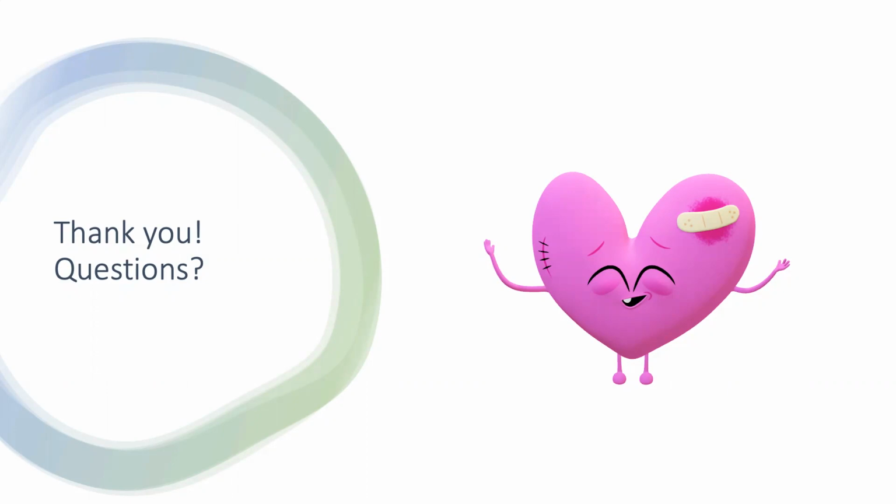Yeah, sure. We have a TEE service 24/7, and we are geared towards doing transesophageal echo portably anywhere in the hospital. If it's needed, for some patients who are unstable, or someone who has really bad renal failure who couldn't go to CT scan, we are here to do the transesophageal echo at any time, any day. Obviously, off hours will take a bit of time for us to come in, but otherwise during work hours, we're right here and there for you. But I'll let my other colleagues answer as well.